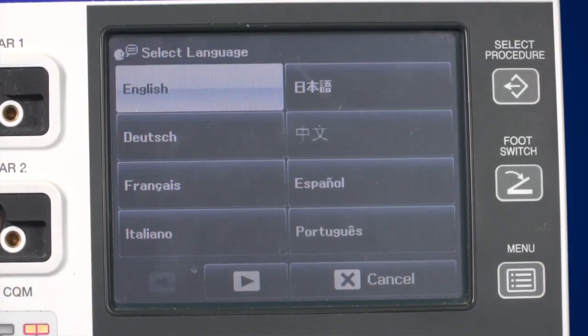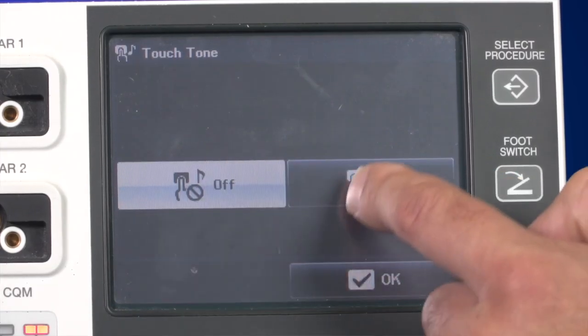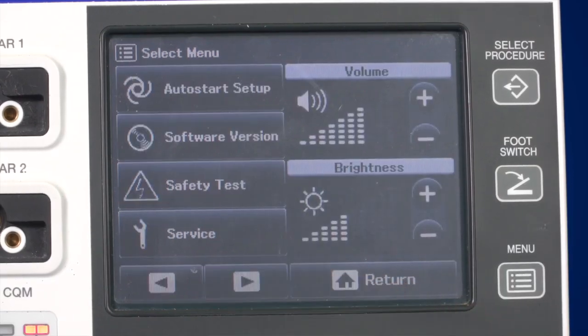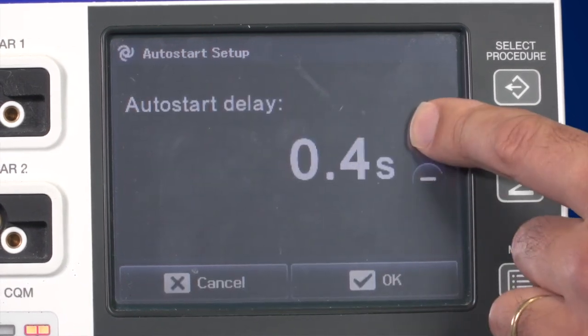You can also choose between eight different languages. The touch tone button allows you to switch the touch tone feedback on and off. To scroll to the next page of the menu, use the arrow button. With auto start delay, you can set the time at which the activation of Bi-soft coag starts after grasping tissue. The other buttons in this menu area are for Olympus service technicians only.